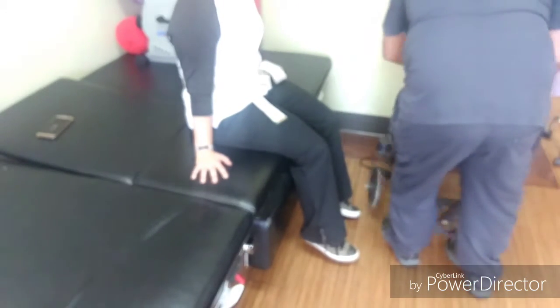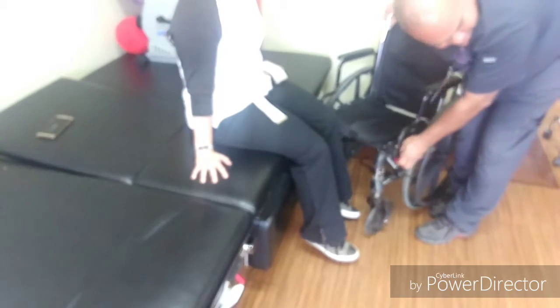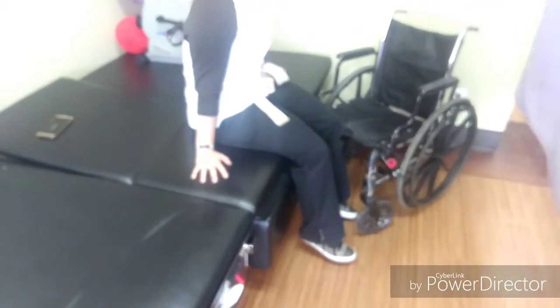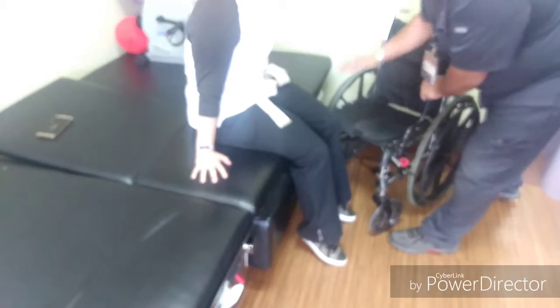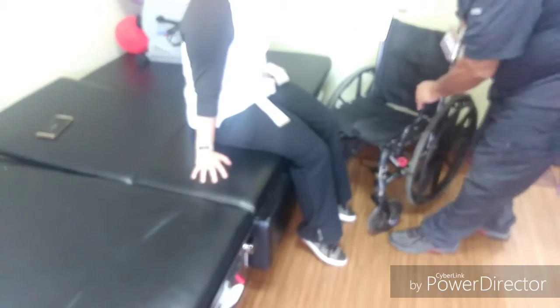I'm going to bring the chair as close to Fred at an angle as possible, and we're going to lock it. Thank you for maintaining my privacy. Absolutely. Now, we're going to lift up this armrest to get it out of the way. Some of them lift up. Some of them just basically come right off. But this one will lift up. So let's get it as close to him as possible.